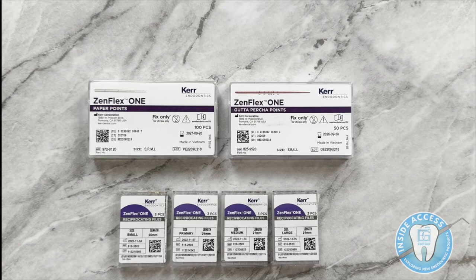The next new product is the Zenflex One system, a reciprocating file system from Kerr Endodontics. Zenflex One is designed to be reverse fluted, so it's used in a reciprocation motion. It comes with its own gutta percha as well, making it a complete system. It can be used within the Elements Connect motor. So we have three new products to discuss — let's dive in and look at the details of each one.